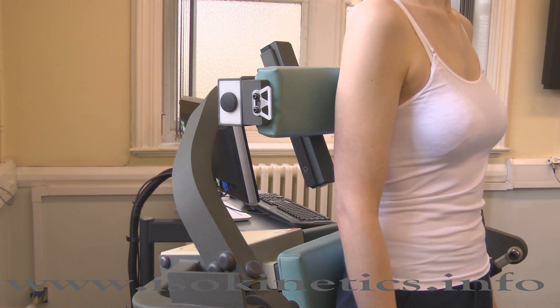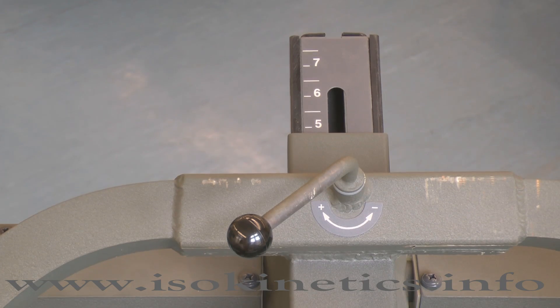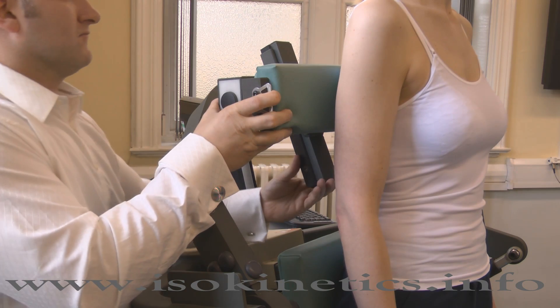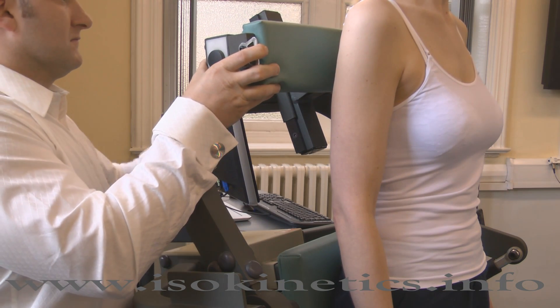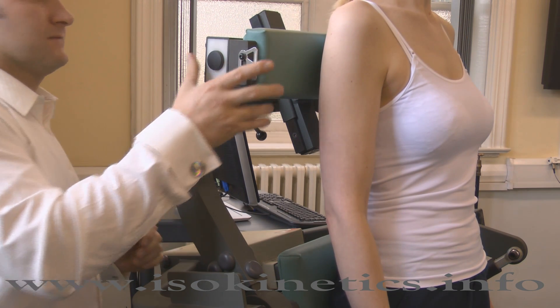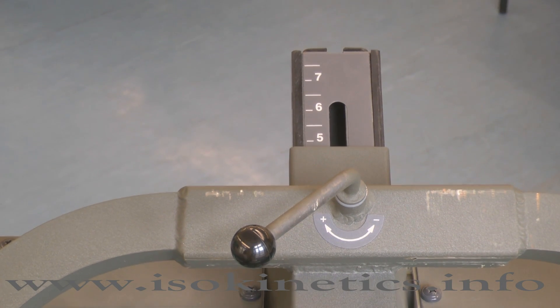Now adjust the scapular pad. Release by turning the handle counter clockwise. Adjust the pad until it is just below the spine of the scapular. Secure by turning the handle. Note well: this handle should not be over tightened. The height of the scapular pad can be seen here.